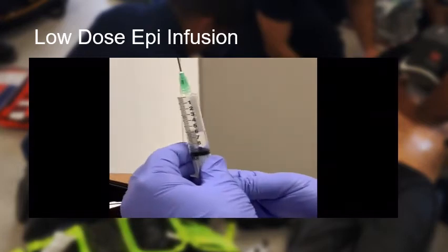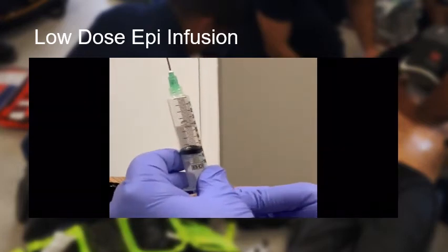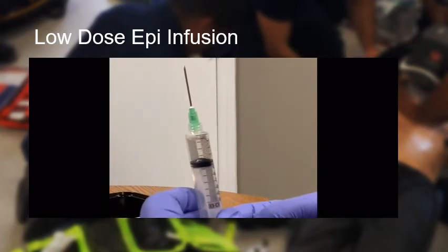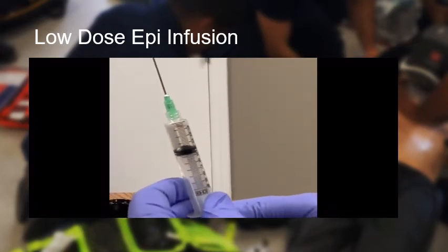Once you have drawn up 4 mLs or 4 milligrams of epinephrine 1 milligram per 1 ml, push the medication into your IV bag.